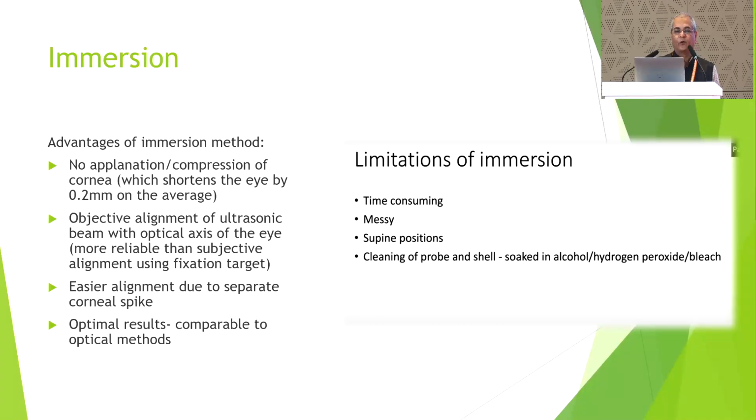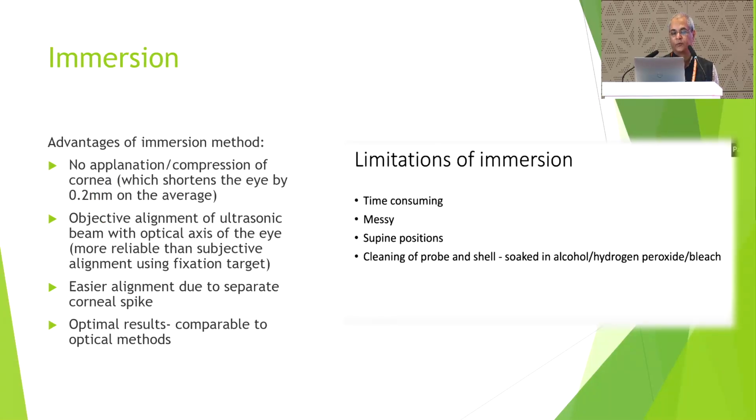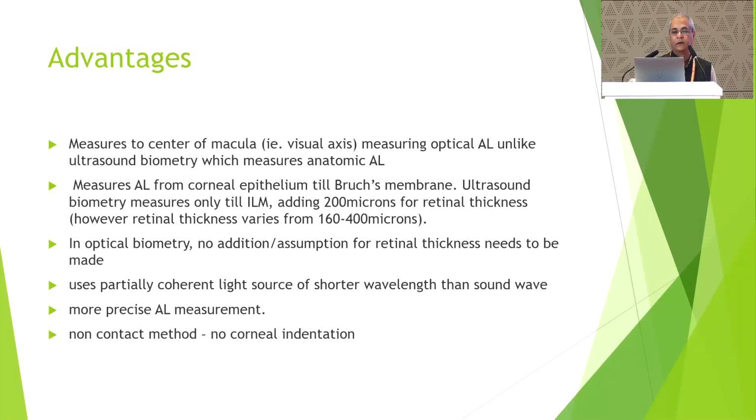So this is the advantage of immersion, and it is almost comparable to the optical biometer. The only thing we have to understand when we are using immersion along with Lenstar is that the A constant will change, because it will go up to the internal limiting membrane while the axial length with optical is up to the retinal pigment epithelium. So optical biometers are highly accurate, non-invasive, currently the gold standard, and I think the first IOL Master came in 1999.